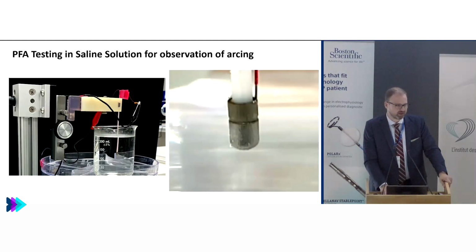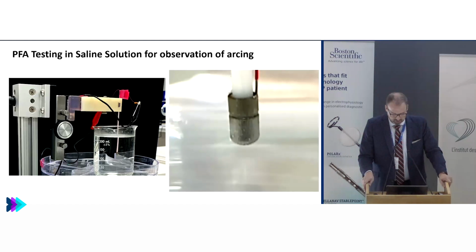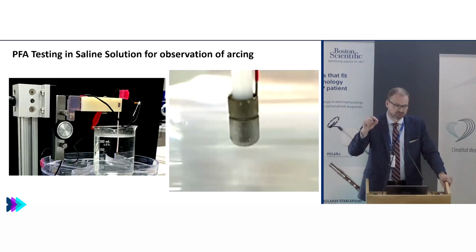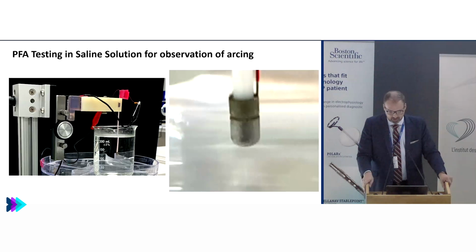Here's a case where we just rammed these two electrodes right near each other, just to show you what this looks like with a basic 5-packet pulse train. This is a slowed down video, but you see right between those electrodes are bubbles and little arcs, and that's because electrolysis is happening. There's enough current density to actually split water molecules into hydrogen and oxygen gas. And if you were looking really hard, you probably saw that it was only happening on one side. So it gets into the chemical reaction of what's happening there. It's hydrogen bubbles that you're creating just through electrolysis, not through heating. So we obviously want to avoid that.